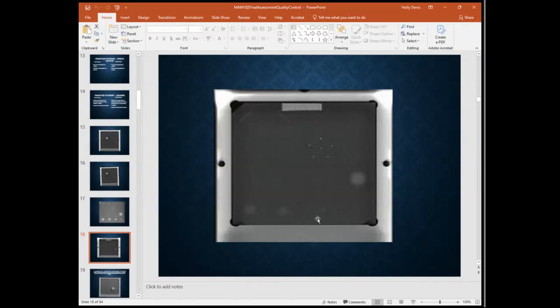How long does QC normally take? We used to only schedule it for about 30 minutes in the morning. They do that first thing before they do the patients. Yep, exactly. And all it is is just one image of this particular phantom, and then you go in and score it and put it in your documentation.